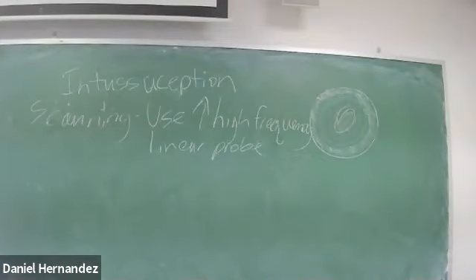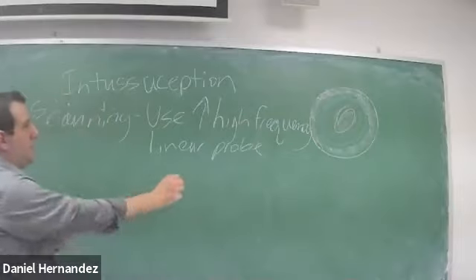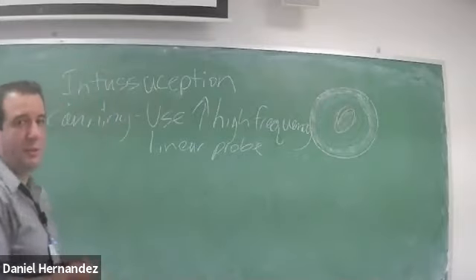The reason we're using a high frequency linear probe is because we want to have good detail and good resolution. And the other reason is the typical age range for an intussusception.